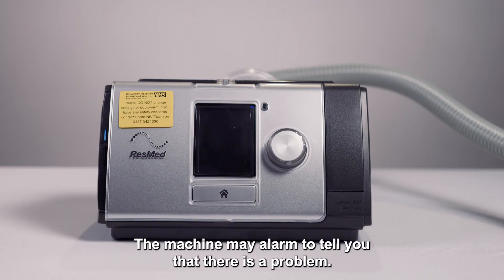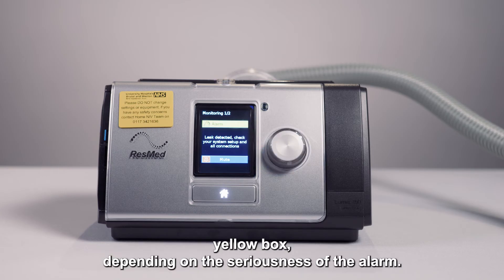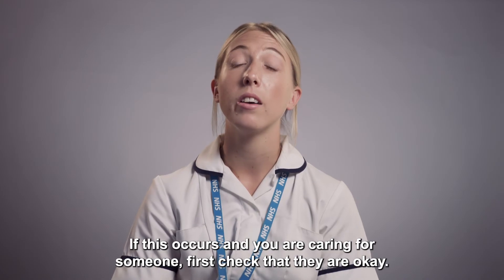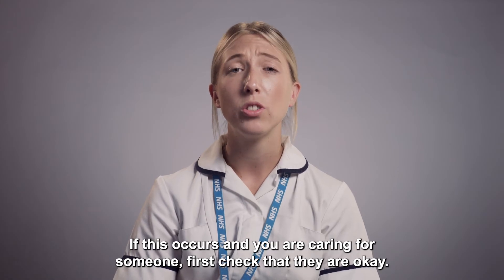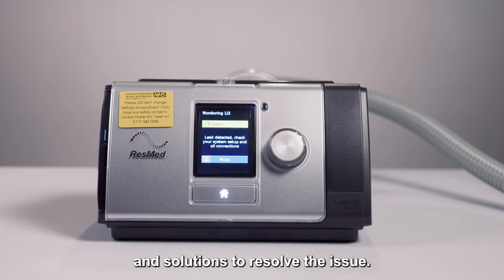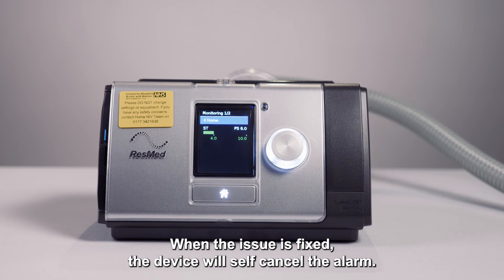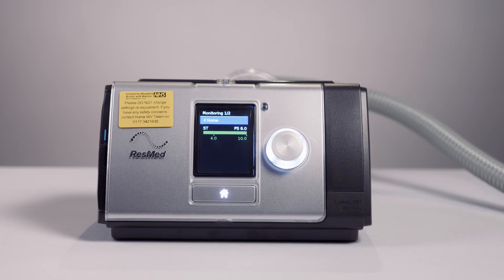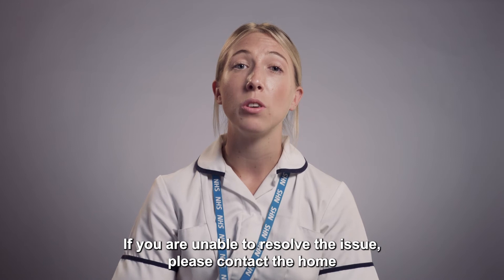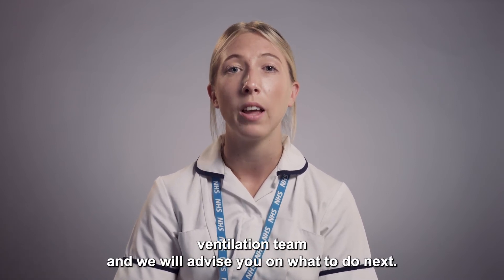The machine may alarm to tell you that there's a problem. A message will appear on screen in a red or yellow box depending on the seriousness of the alarm. If this occurs and you are caring for someone, first check that they are okay. The message on screen will give you a list of possible causes and solutions to resolve the issue. When the issue is fixed, the device will self-cancel the alarm. If you are unable to resolve the issue, please contact the home ventilation team and we will advise you on what to do next.